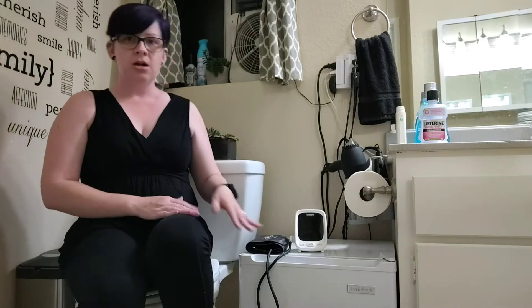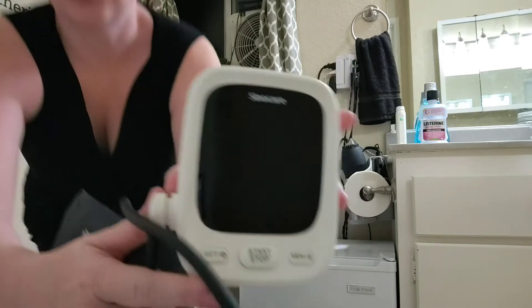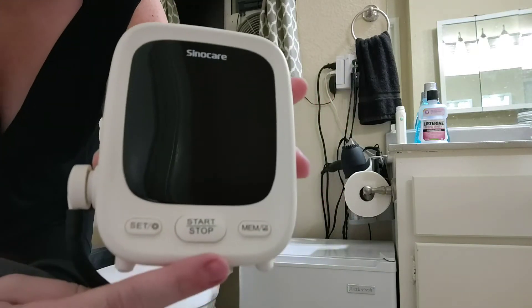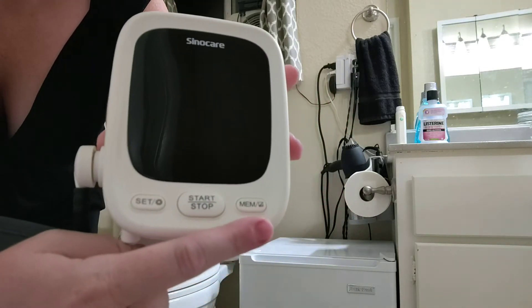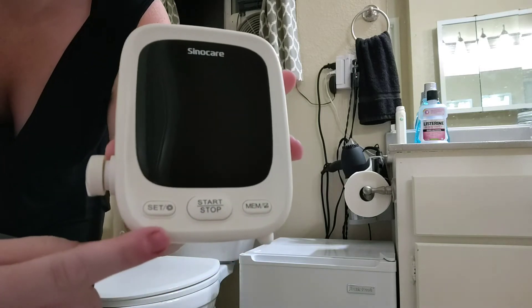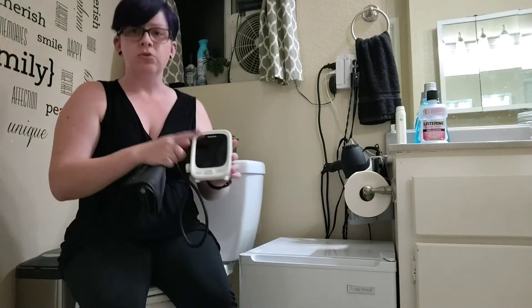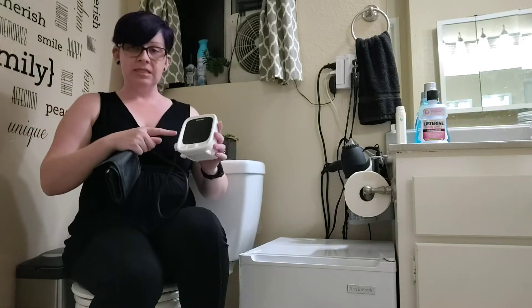That's why it's in here. We have a start/stop button in the middle, a memory button because you can store readings in here, and a settings button. What I like is this machine will speak out loud and walk you through the steps to take your blood pressure.